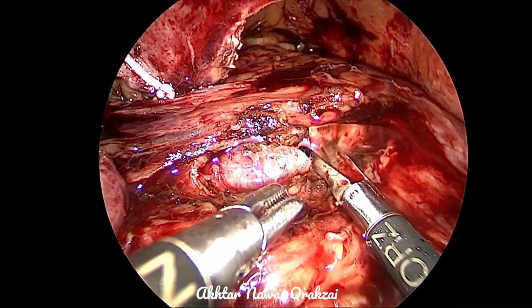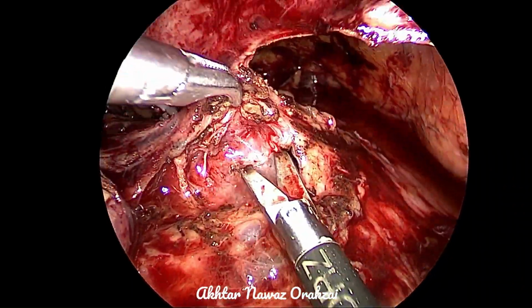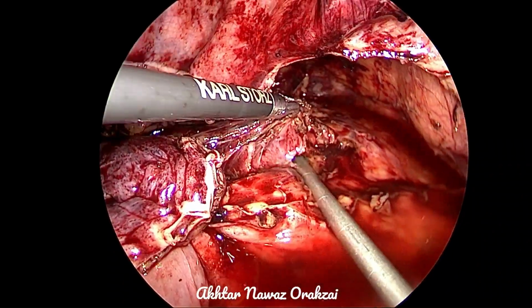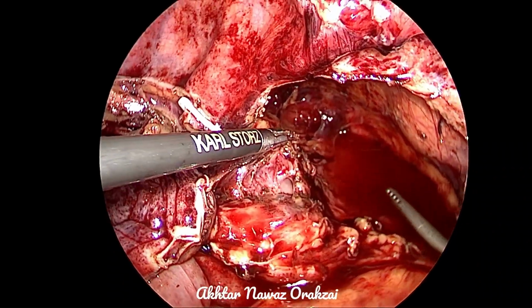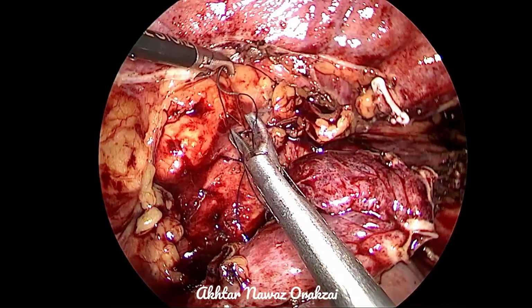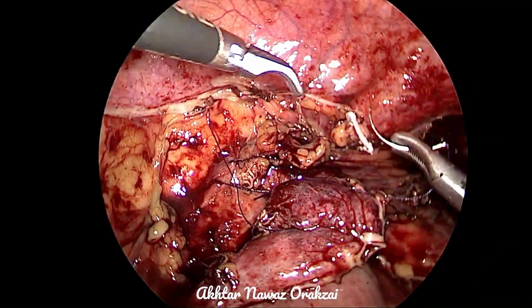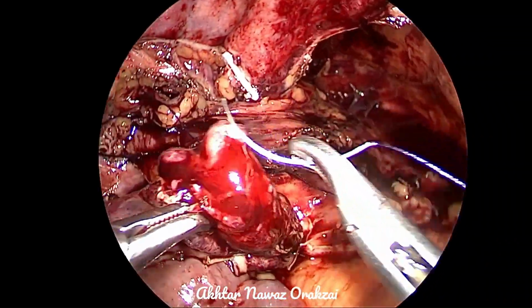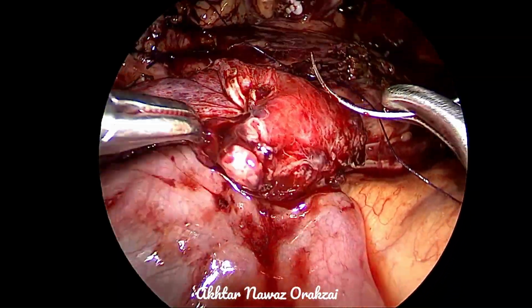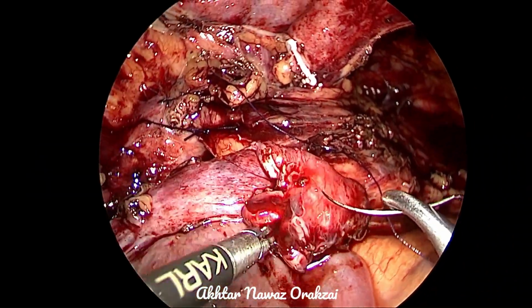The same area is used for cutting where the bladder mucosa was opened traumatically. So the ureter will be anastomosed to the tip of the mobilized area. We take 4-0 Vicryl. Different sutures can be used. 3-0 Vicryl can be used. 4-0 Vicryl can be used. Some people use even PDS, and some people use V-Loc sutures.